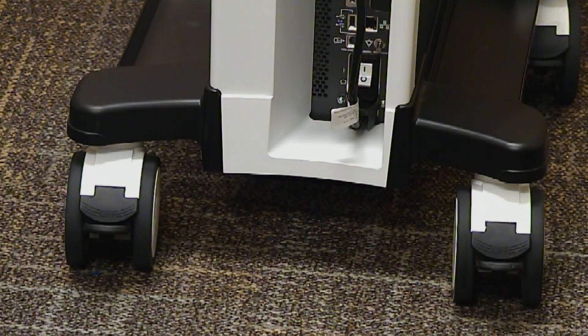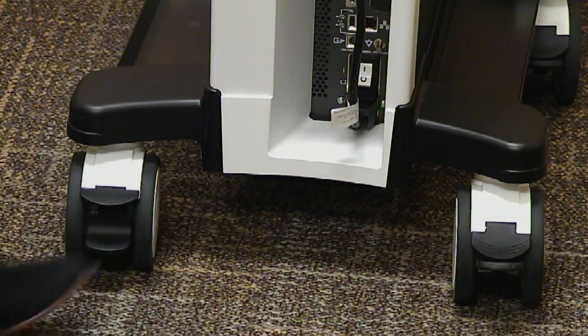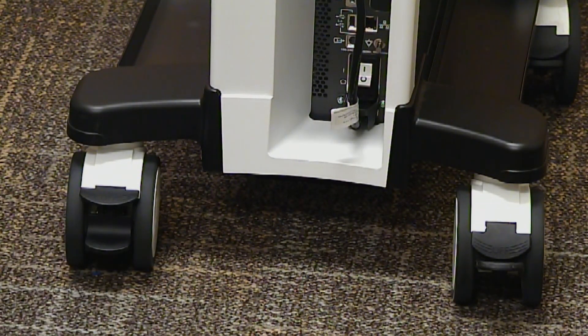To activate, depress the bottom lever. To deactivate, depress the top lever.